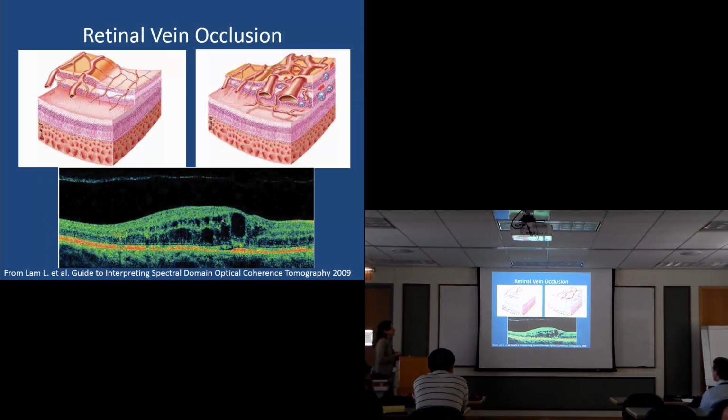I wanted to include some histology again to see just exactly how great OCT is in looking at the structure of the retina. So as we talked about, one dilemma is that as they're made, the vessels go through the neurosensory retina. So if there are problems with the vessels, there are problems with the retina. This is an example of a vein occlusion. We're not sure still where that vein gets occluded. Our hypothesis is that because the artery and vein share a common sheath, the arteries can get hard in atherosclerotic disease, push on the vein, cause a backup in flow. VEGF is released, which is vascular endothelial growth factor, and then that causes swelling within the retina.